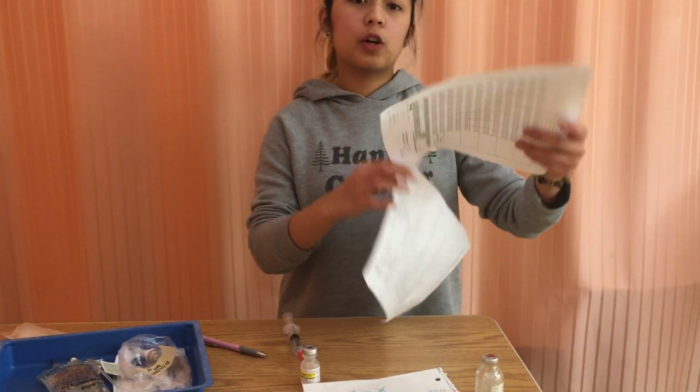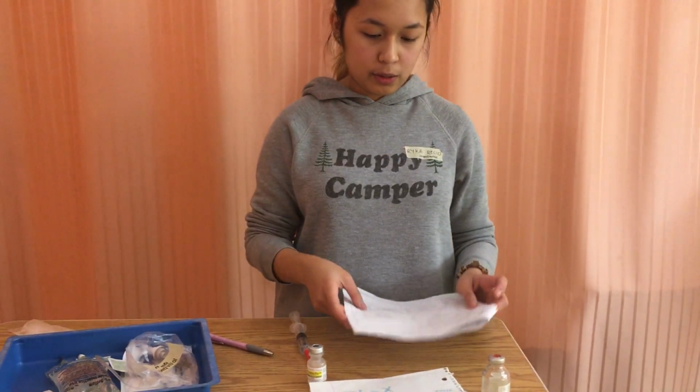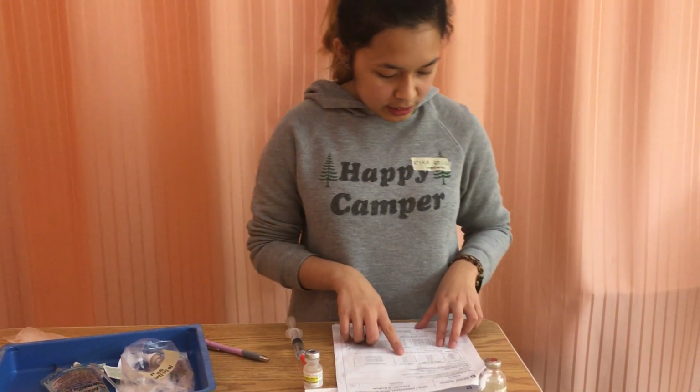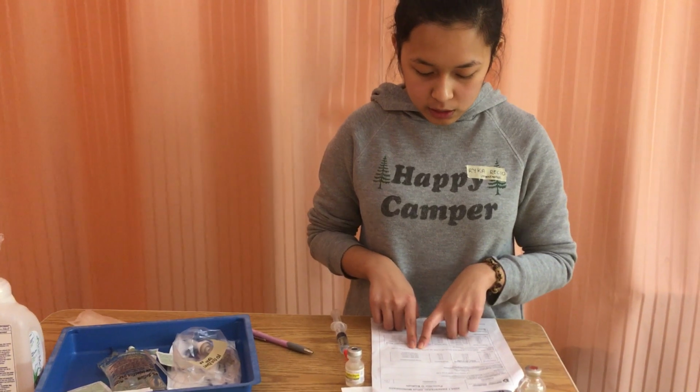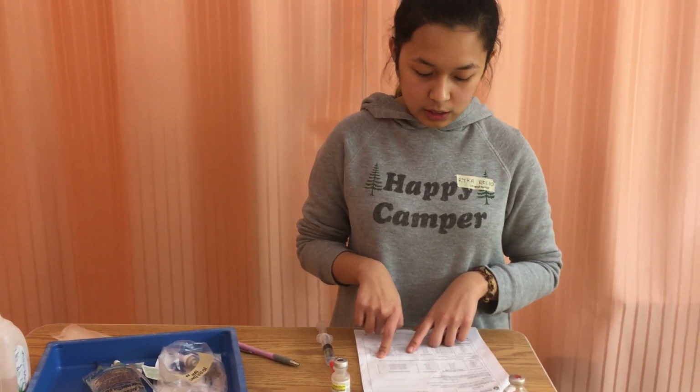Now for dilution, I'm going to refer to the monograph again, and it says that IV push is not recommended, so I would give this IV intermittent. And it says to dilute the dose in at least 25 to 100 milliliters normal saline or D5W or normal saline mini bag, and to administer this over 30 to 60 minutes.